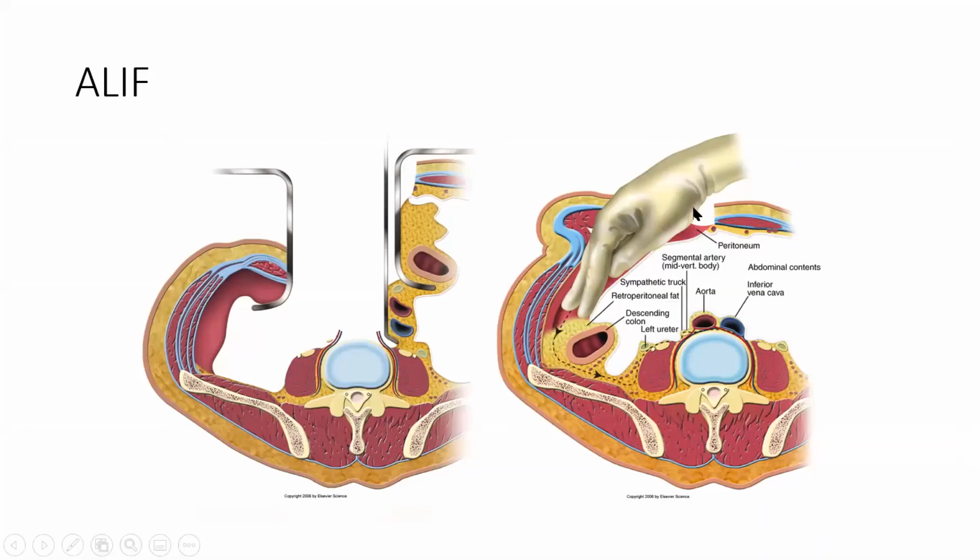So basically, you come around the retroperitoneum, and you come out here on your iliacus, and so as you pull your structures across, you don't see any intestines. You're going behind everything. Your ureter also goes with the peritoneum, so you don't see the ureter in the way. And you have the psoas muscle, and I think the genitofemoral nerve and some other structures there. It's a nice retroperitoneal approach.